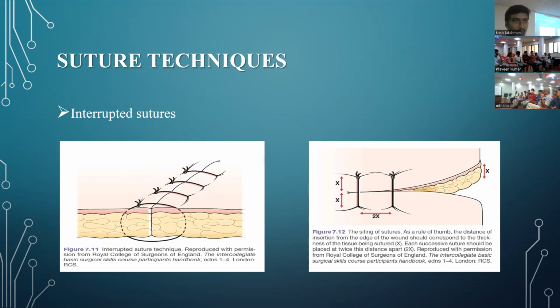And I keep repeating it, I mentioned it in this basic skills course. All these are important things: surgical knot, lacing the knot, distances. You have to be precise at this stage, and it becomes a part of your regular practice. It's called internalization. Many senior surgeons will not be following this, but I urge you, have the habit of doing it.